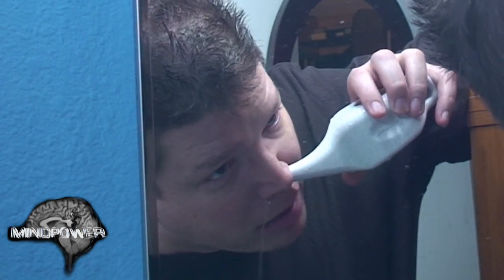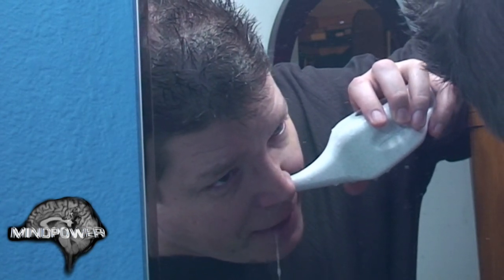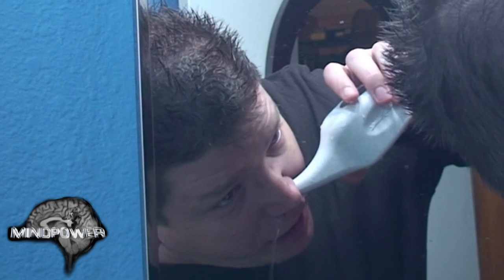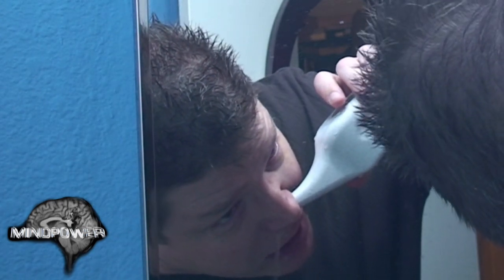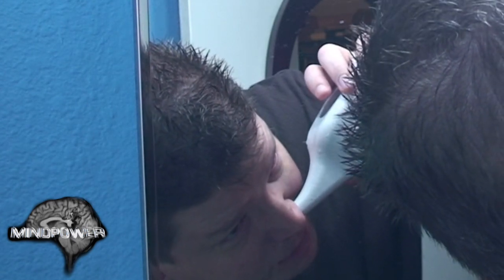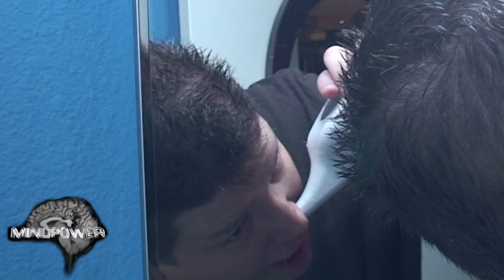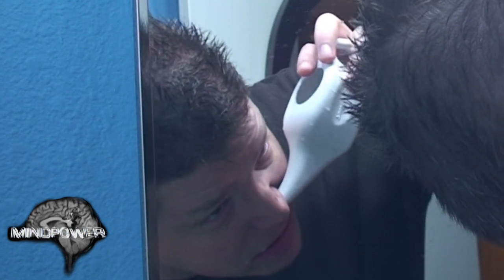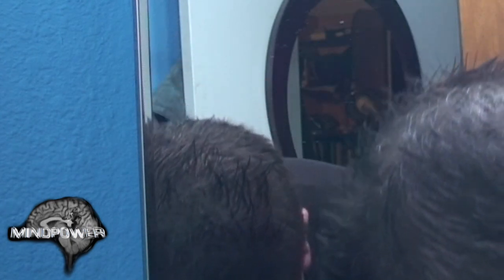And if some water comes out of your mouth, that's okay. It'll kind of taste salty and gross, but it does clean out the sinuses.